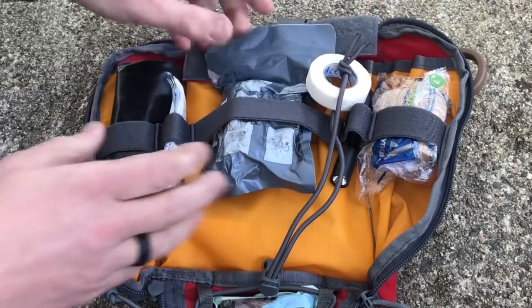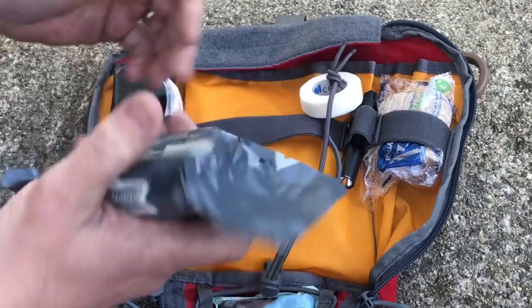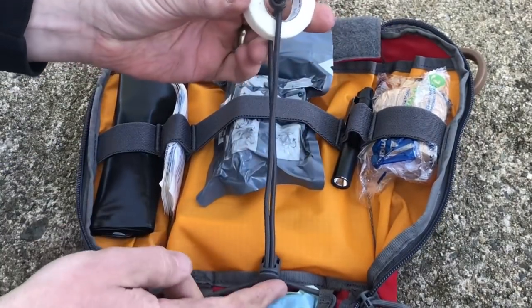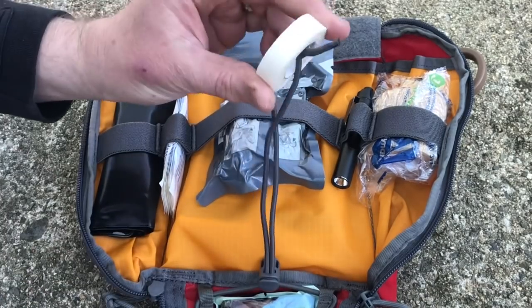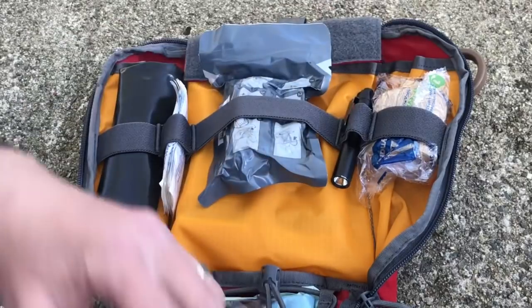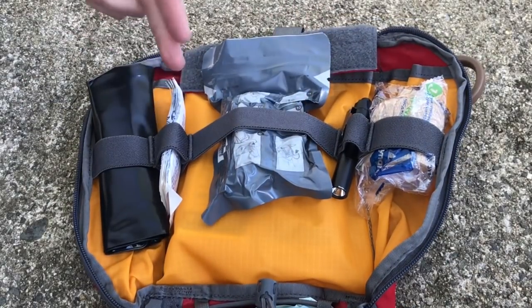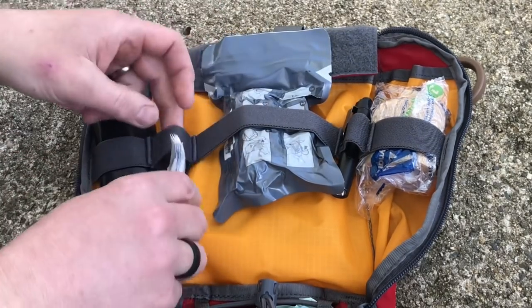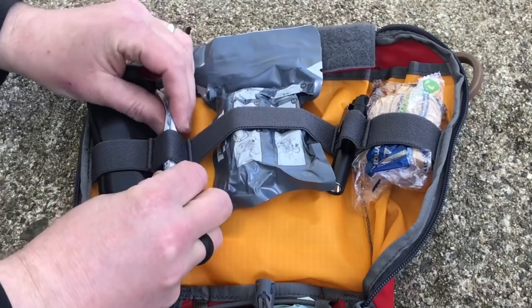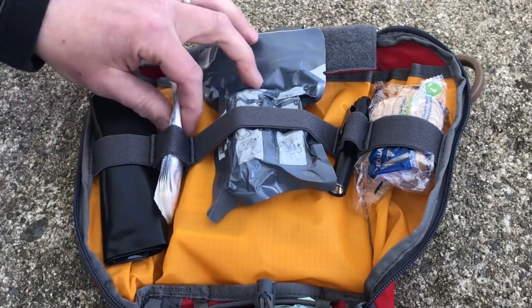First off, an Israeli bandage — good till 2023. Then I've got some medical tape. The bungee actually goes down to the lower section but I just untied it, looped this through, and tied it off again so I can get it out of the way. In addition to the Israeli bandage, I've got a bunch of band-aids. I want easy access to these. This is obviously a kit for more serious medical situations, but also for scrapes and cuts and stuff.